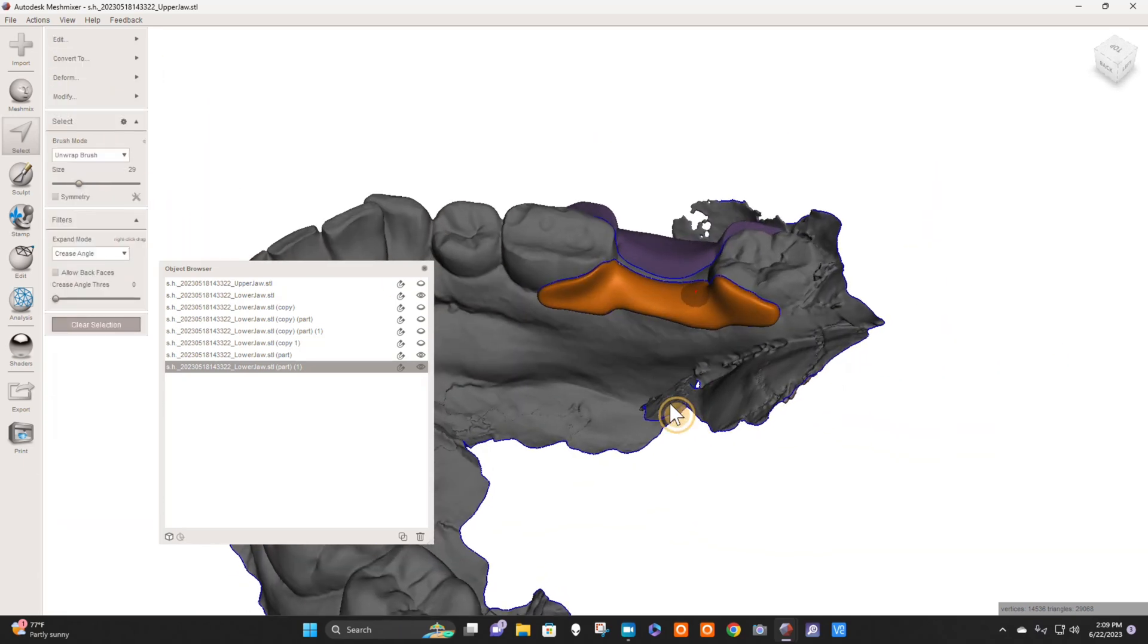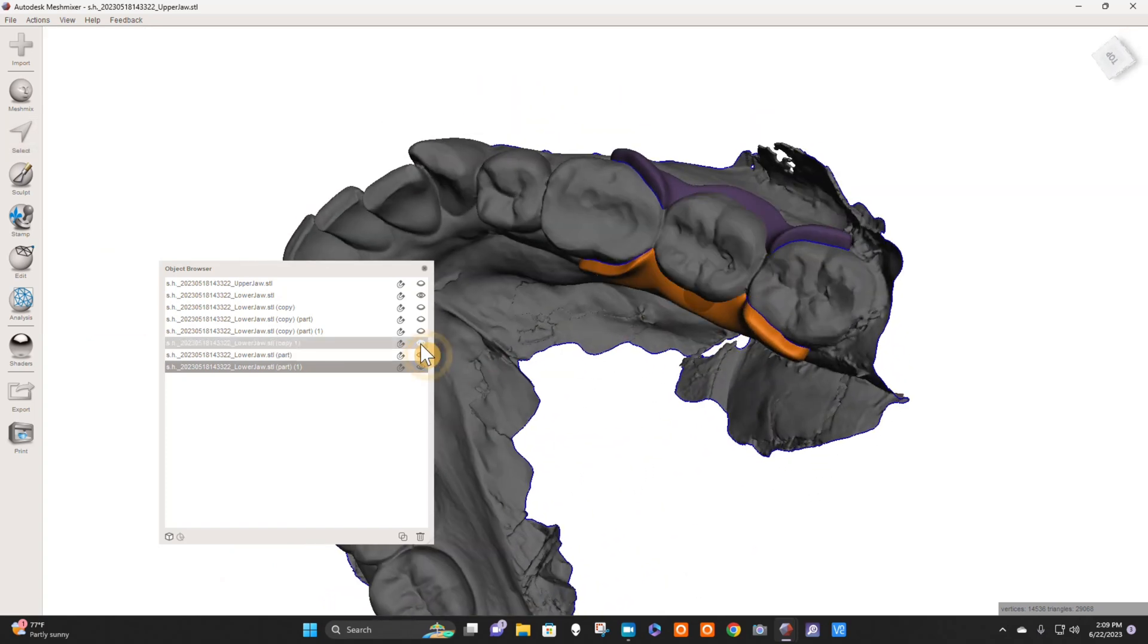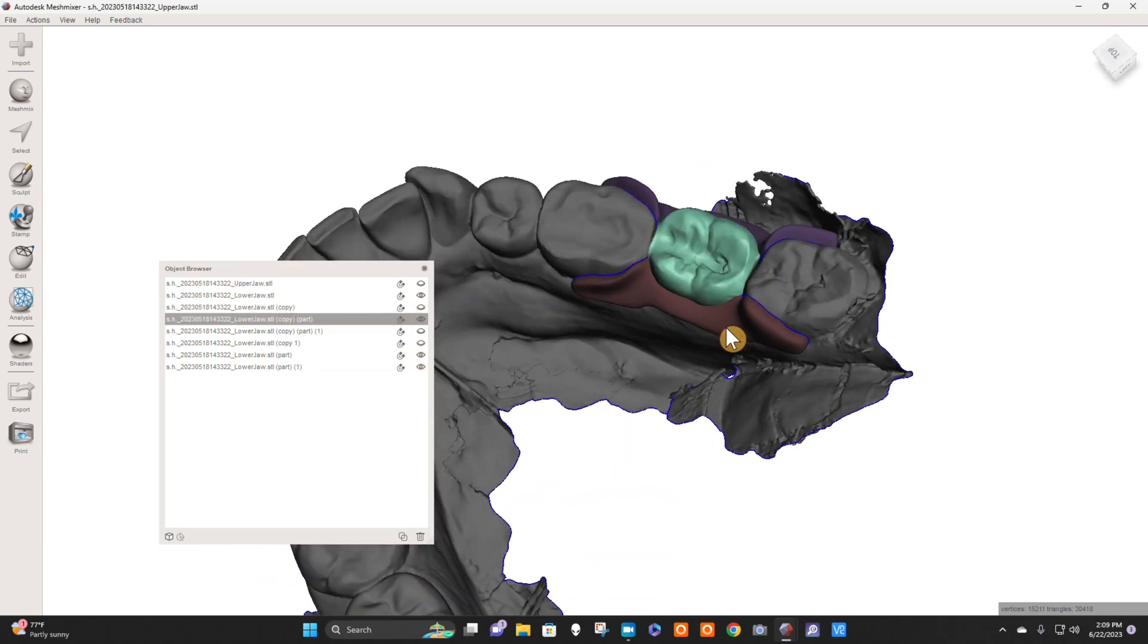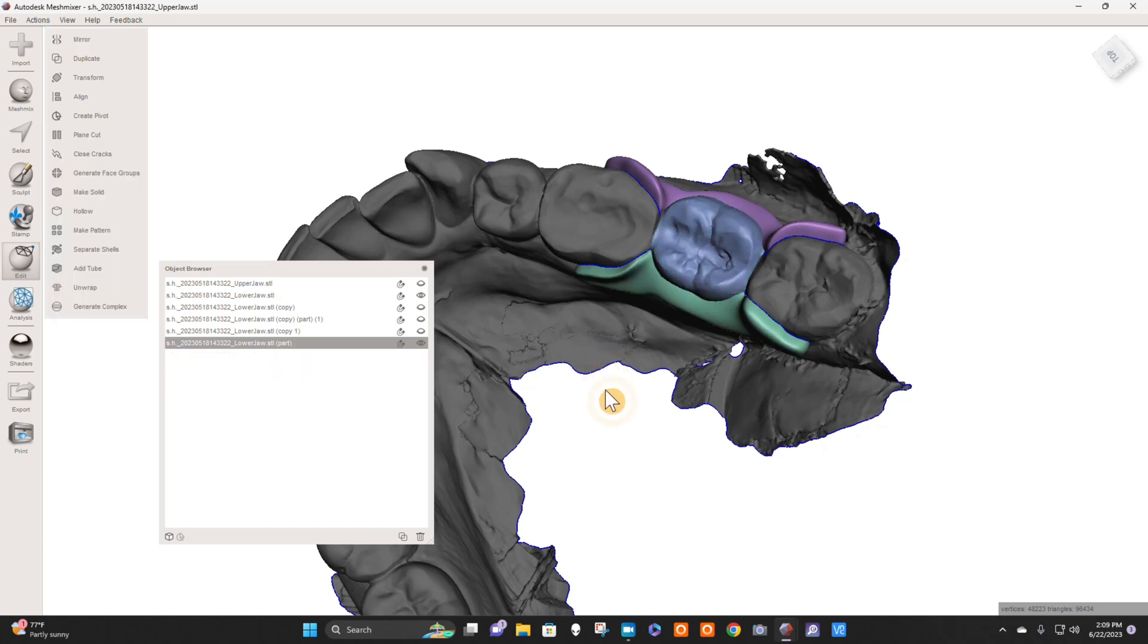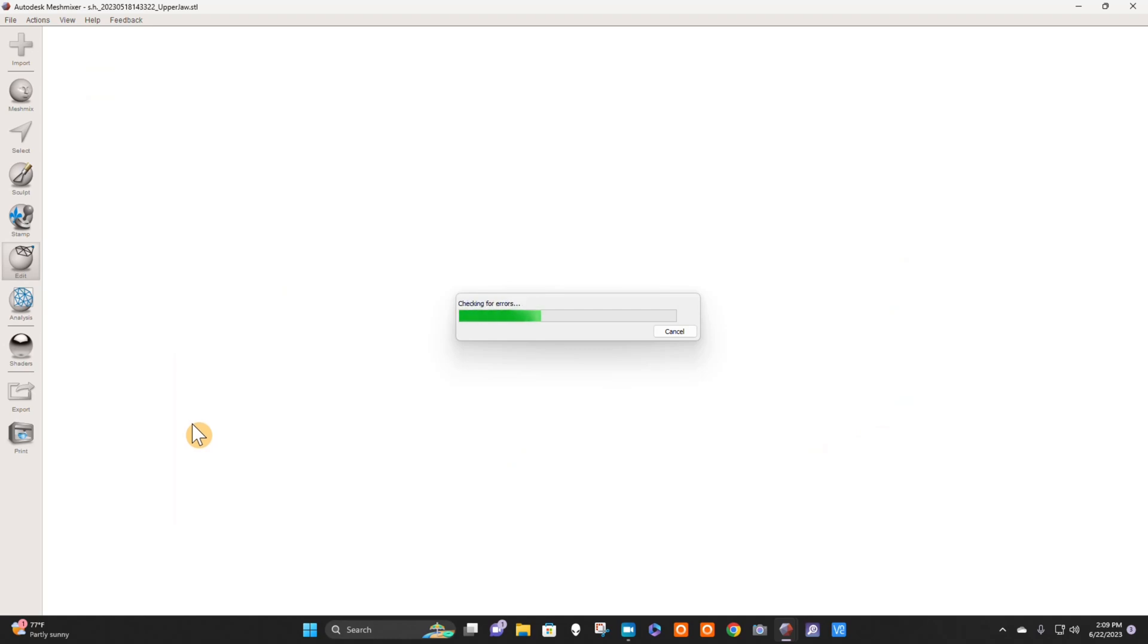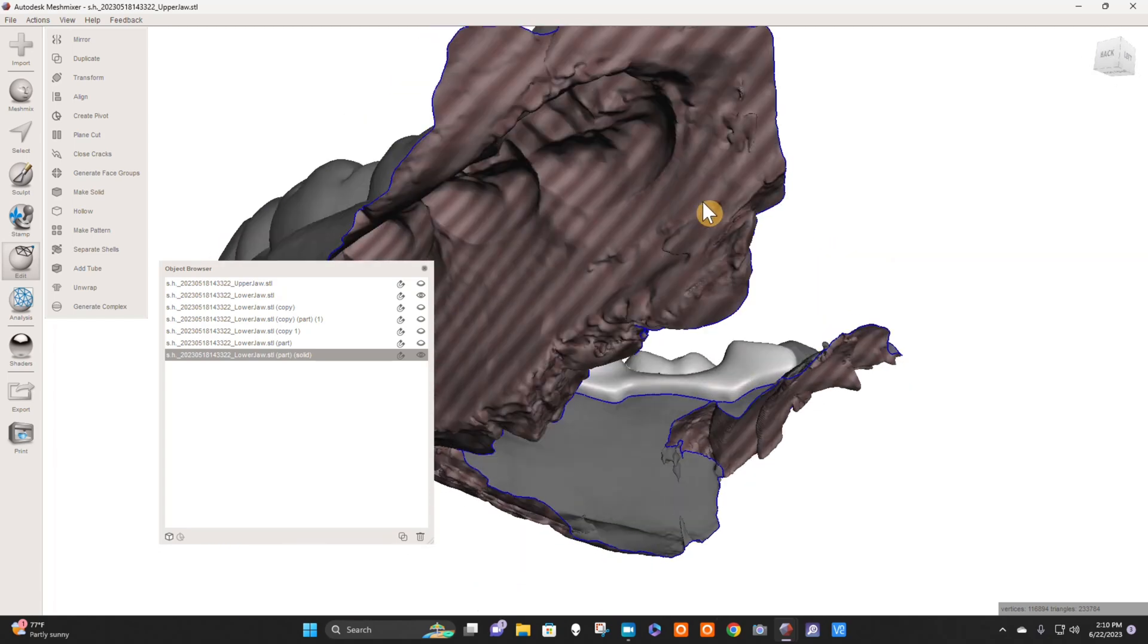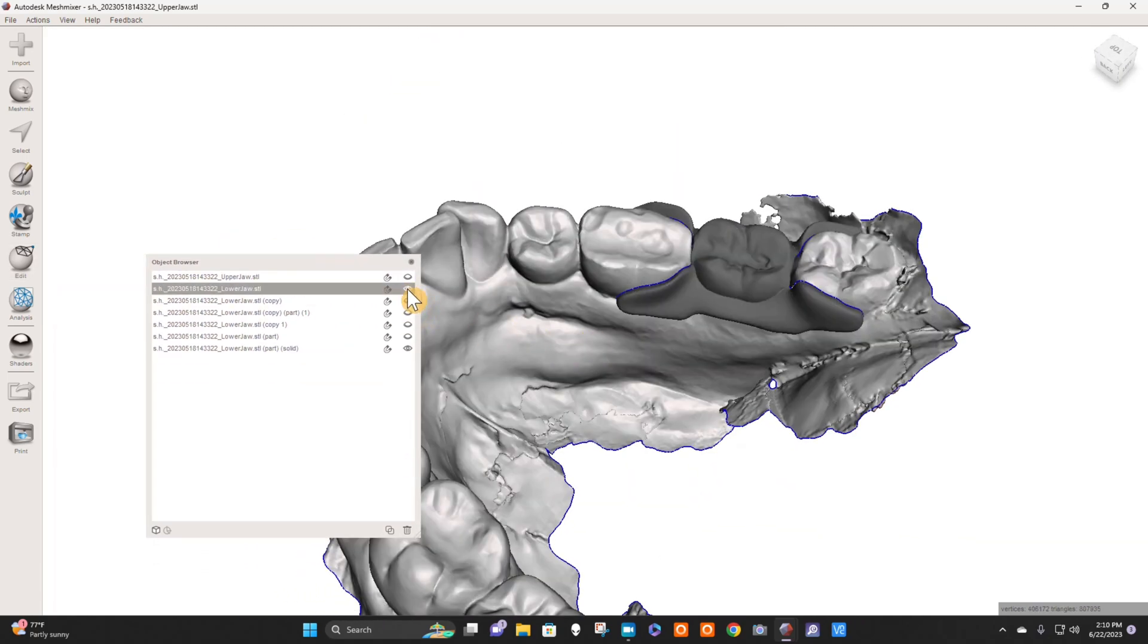There we go. Now I have these two pieces here, and I have my tooth. There's my little tooth, beautiful. So I need to combine these three pieces. So I'm going to hold Ctrl on my keyboard and click these three elements and hit Combine. And then I'm going to go to Make Solid, and I'm going to hit my accuracy in the middle, accurate here, mesh density in the middle, Update, and hit Accept. Now I have a solid mesh here. And the thing that I need to check now is how well it fits.